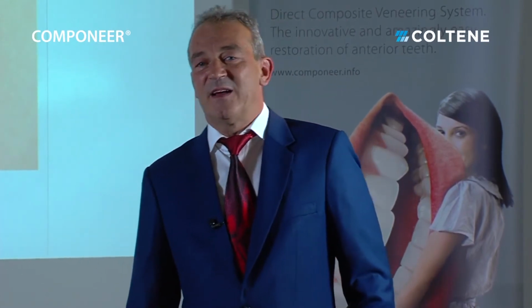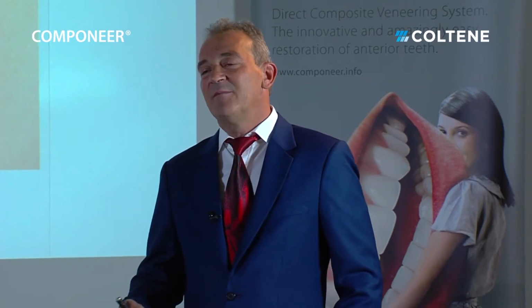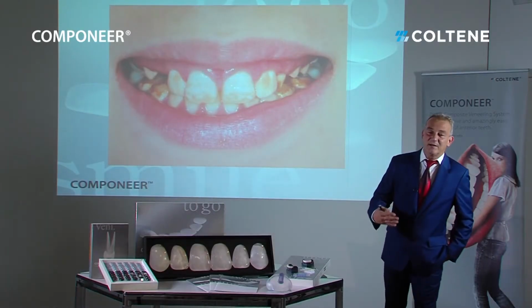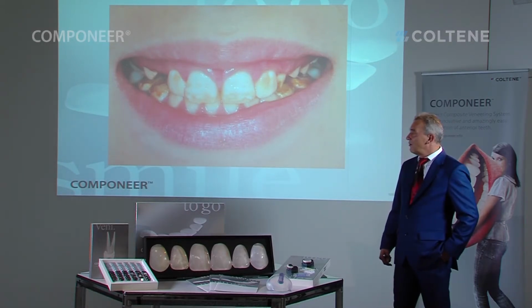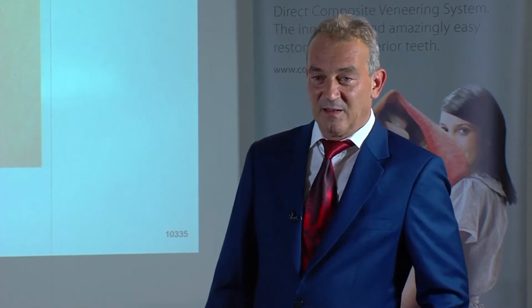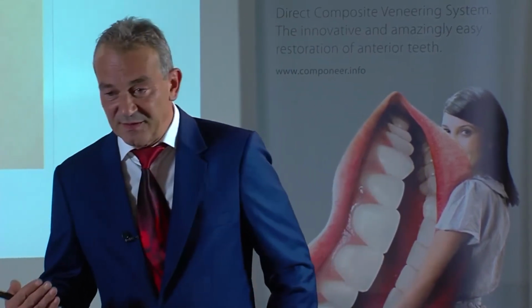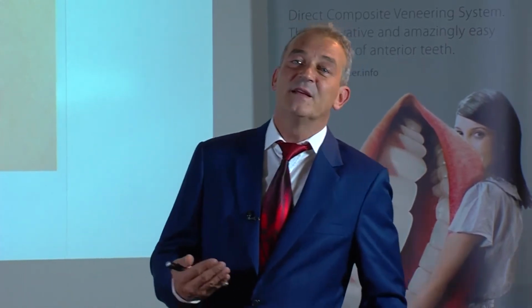This chapter is devoted to special cases. This means special cases in the widest sense. These are cases which do not occur in daily practice, which sometimes also lead to headaches. We've already heard that Componeer is an efficient system. And efficiency is often the name of the game when we have to treat children.